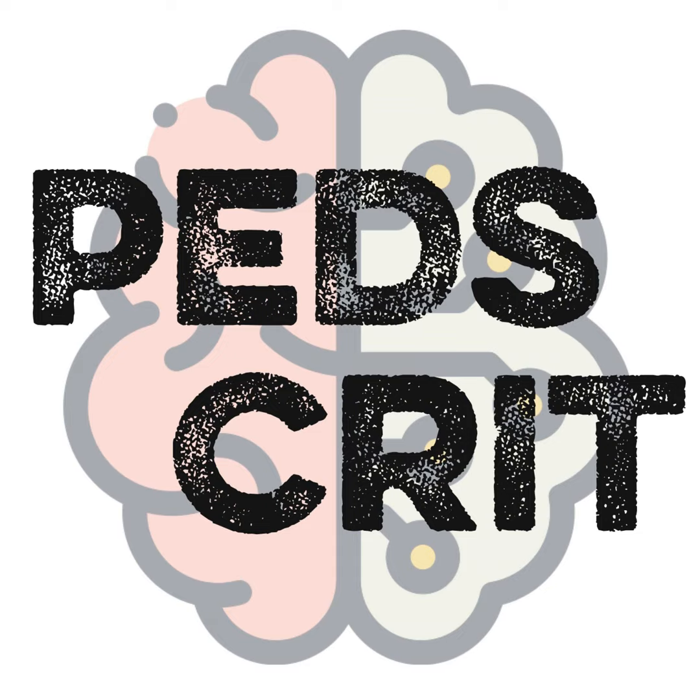And this is why I mentioned that one of the things I pay a lot of attention to is inspiratory and expiratory flow limbs. I really like to make sure that both of them are going to 0, partly for this reason. It makes all the other measurements make sense if the machine is doing what it thinks it's doing. We talk about all of these measurements, like that PEEP is this, PIP is this, tidal volume is this. All of them only make sense if the thing measuring what you think you're measuring is in fact accurate.